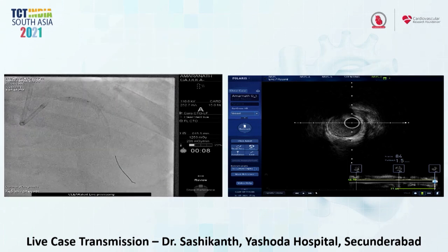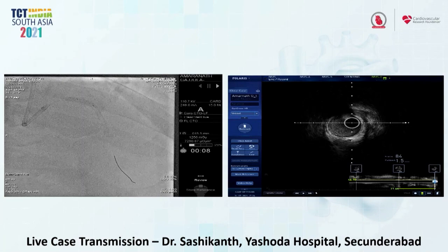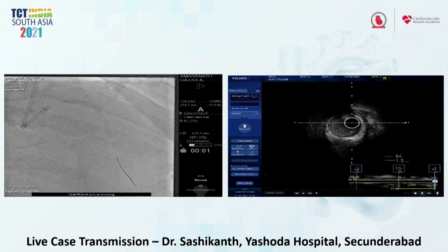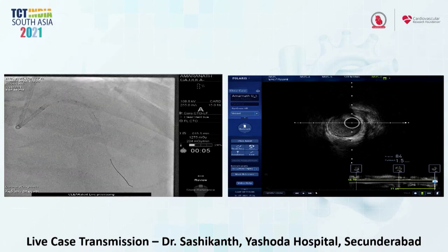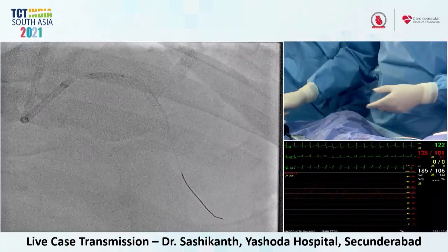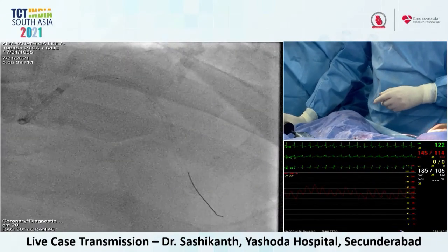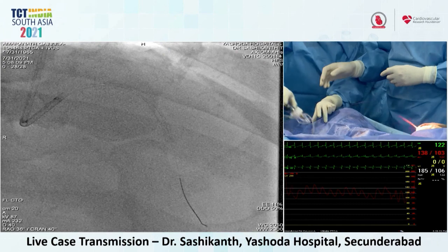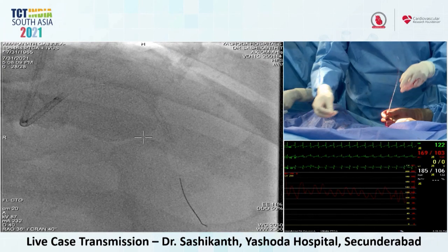So the stent boost is another way you can study these pictures. The only time we would like to inject contrast is when the patient is becoming hemodynamically unstable, there are ECG changes, or the patient is having pain. In that situation, zero contrast PCI would not be the priority. Safety would be the priority. In that situation, I would inject and see what is happening.